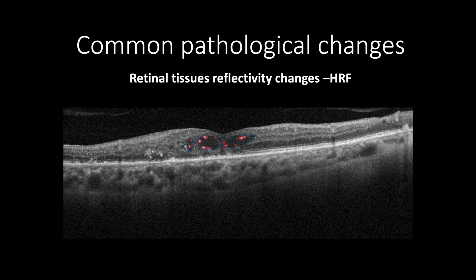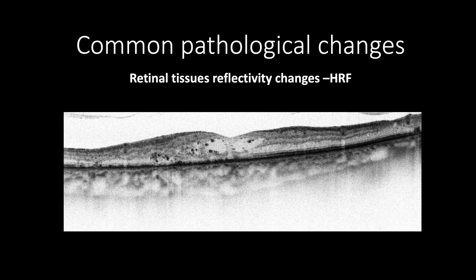However, some authors reported that those hyperreflective foci are lipid-filled macrophages at the inner edema wall. They are predecessors to hard exudates but fade away spontaneously or post-treatment. In negative black and white, those dots are seen more clearly, and negative black and white can be used in cases where we doubt if the hyperreflective foci are present or not, and helps to determine the exact location and number.